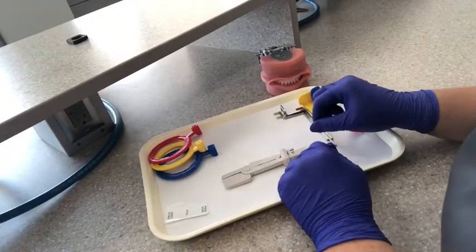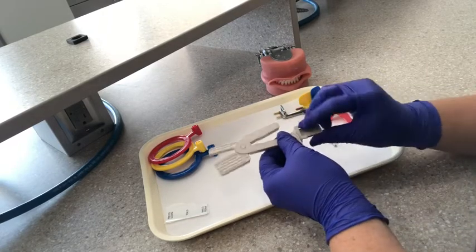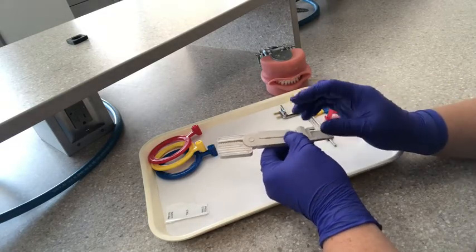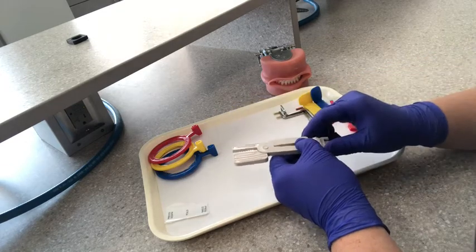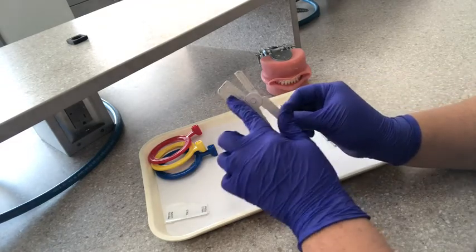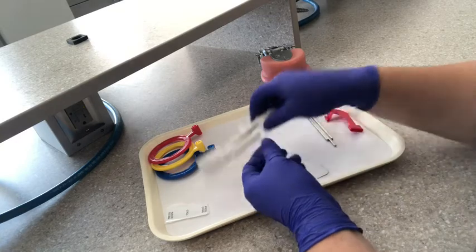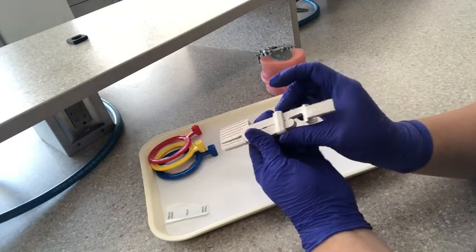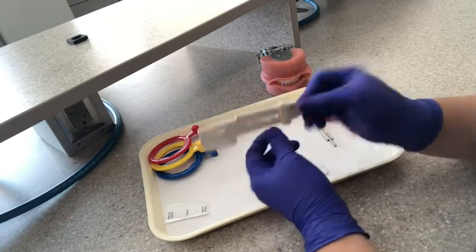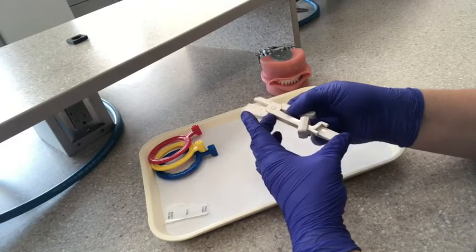Next, we are going to go ahead and show you how to use the snap array. This device here is our snap array. It doesn't have a ring that goes with it — it's its own holder. This would be for patients that have difficulty closing around the other XCPs. It's got a wider part and then a narrow part — I like to call it the little mouth. It has a ring that you would slide down once the film is placed, and that keeps it locked and closed so the film wouldn't slide out.